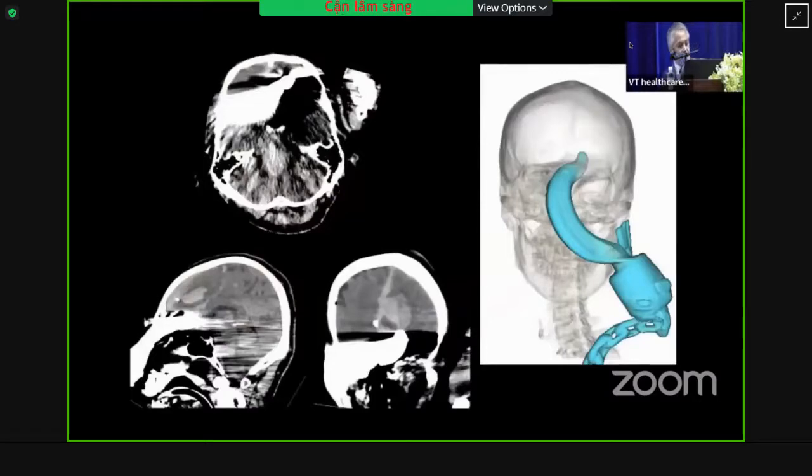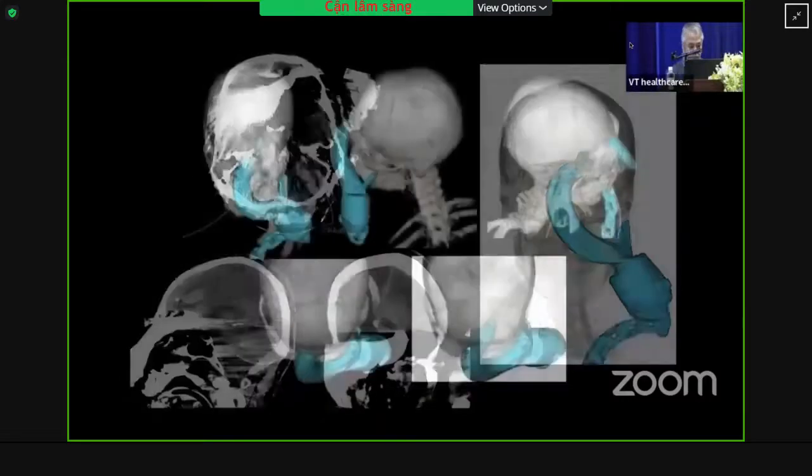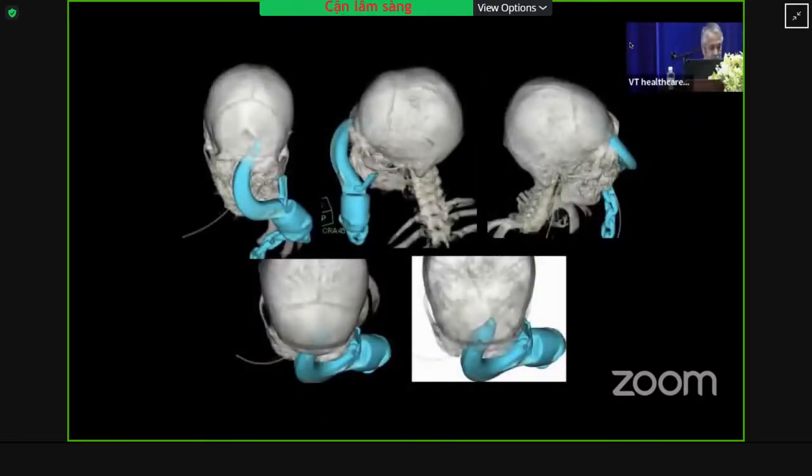The CT image shows some brain damage, but due to artifact, the extent of bleeding is little understood. The relationship between the metal pieces and the brain can be understood from the 3D image. After creating the 3D image shown above, observe at the required angle.